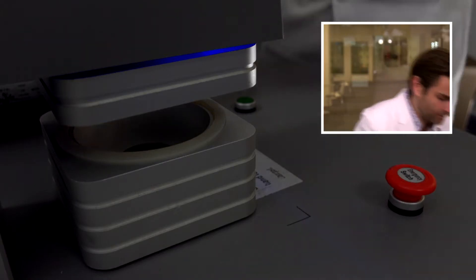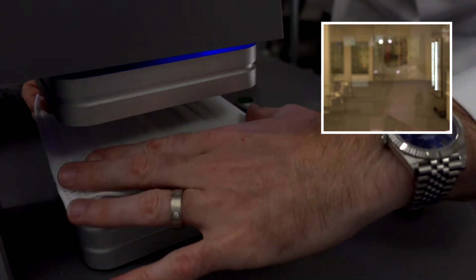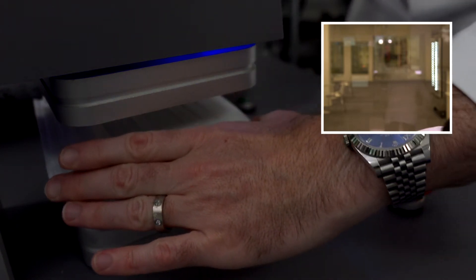Hey everyone, thanks for joining me today. We are testing every simple mask on Amazon, but specifically we are testing American-made masks today. Very excited to test Wisconsin Medical Supplies. What's cool about this box, which we'll get into in a second, is that they actually have their own custom shipper box. But let's get the test going and then we will talk all about that.